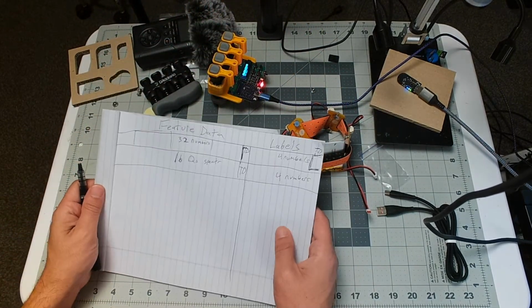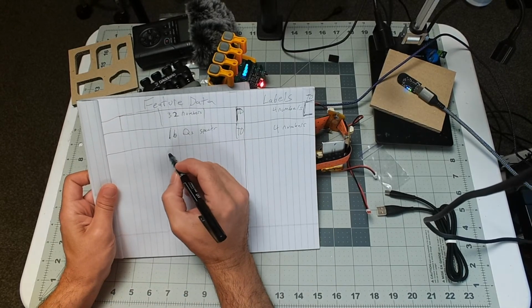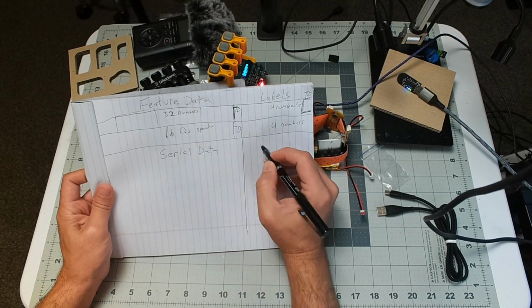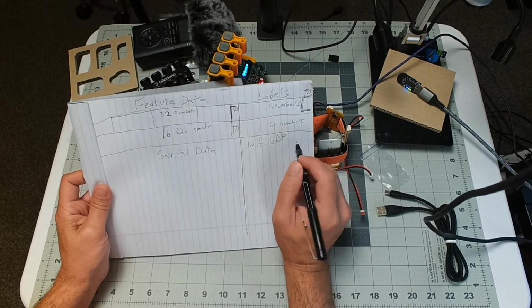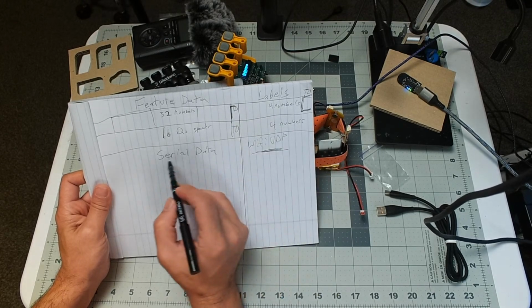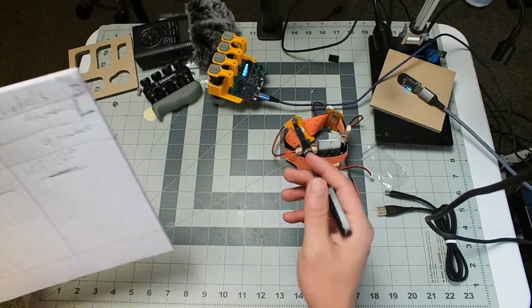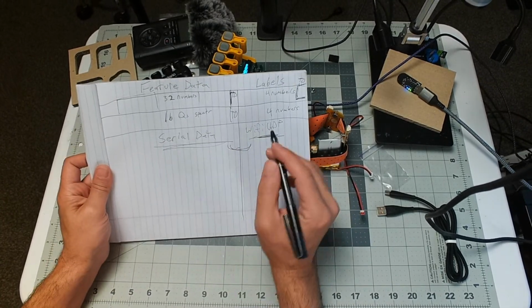But I'm going to work on the code to receive both the serial port data, and this is the Wi-Fi UDP packet data. So I'm using a socket port to capture the labels and using serial port to capture the wireless signal from uMyo. And I'm going to try to create the preprocessor.